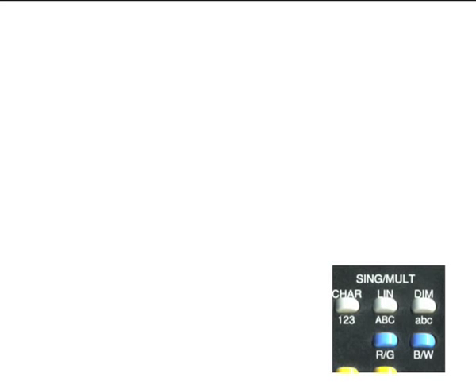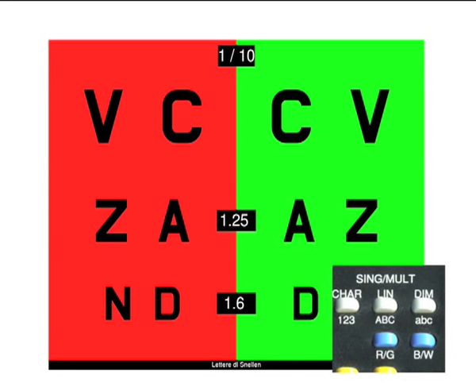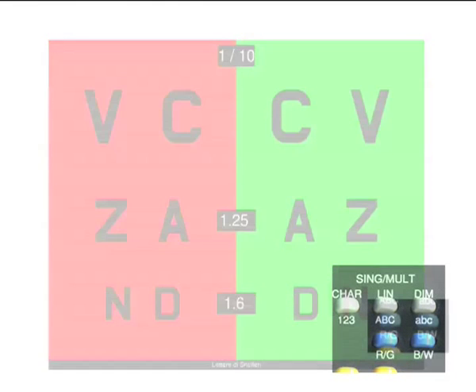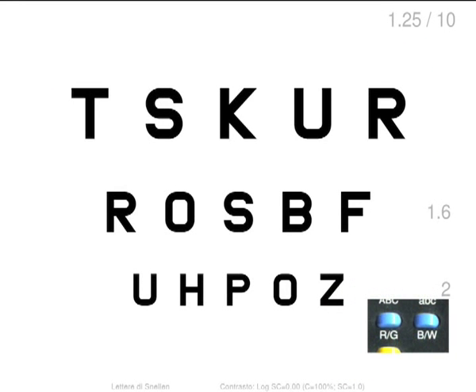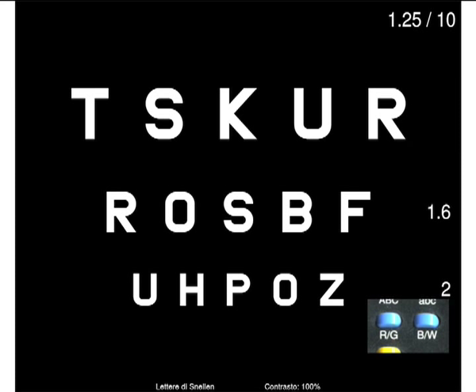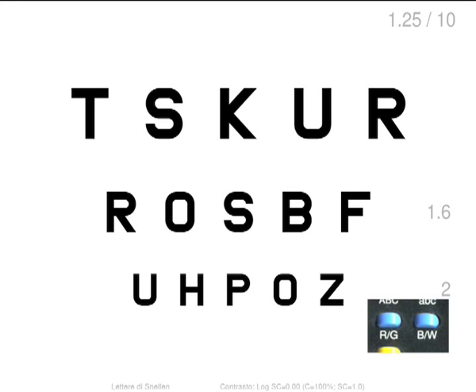Two more displays are visible by pressing the red and green key. A table will be divided with a green background on the right and a red one on the left. The black and white key, on the contrary, allows to invert the background color with the eye chart.